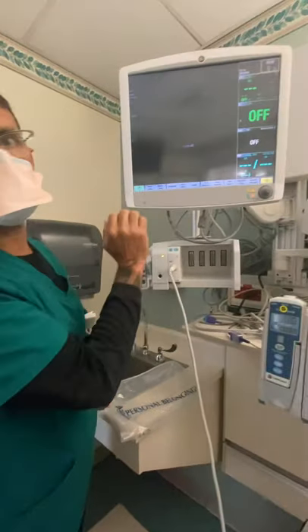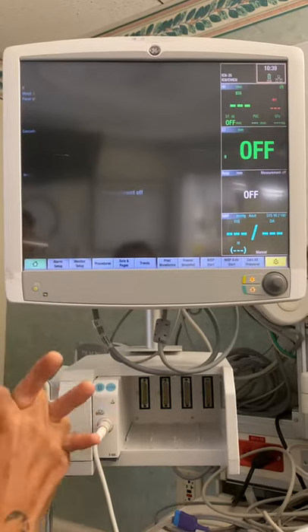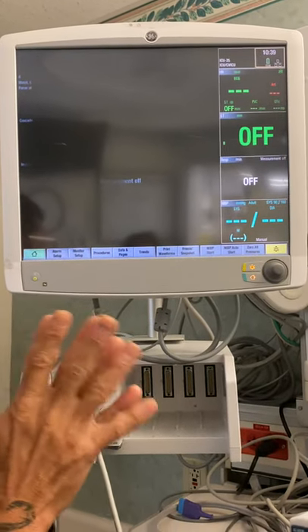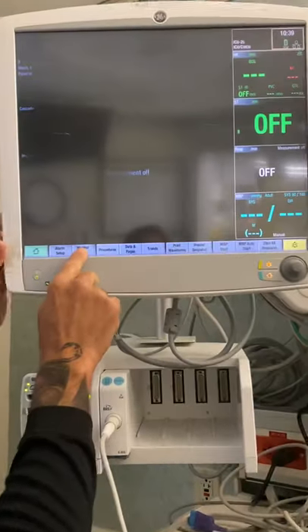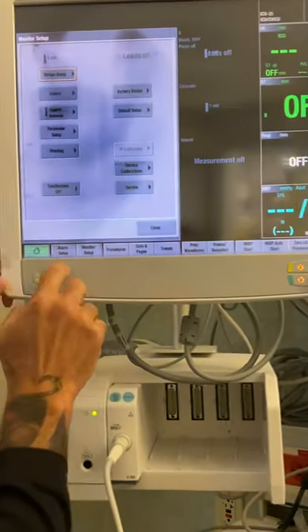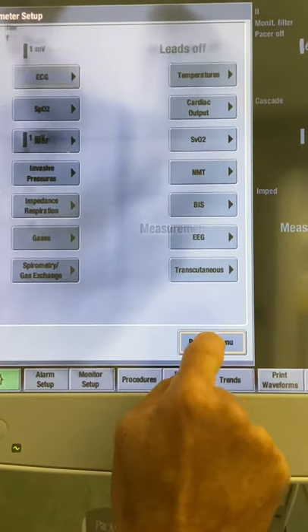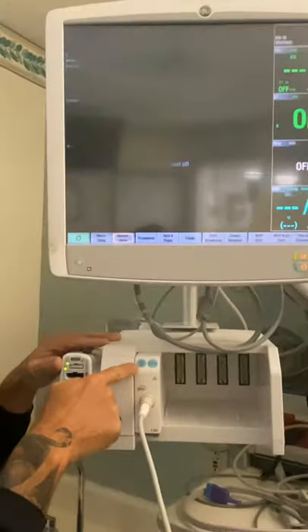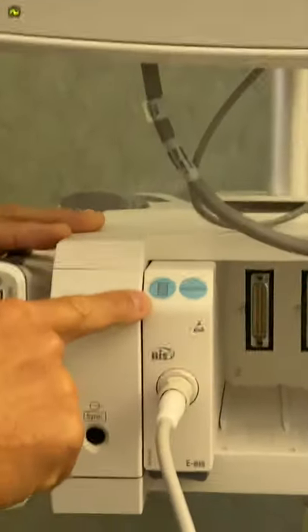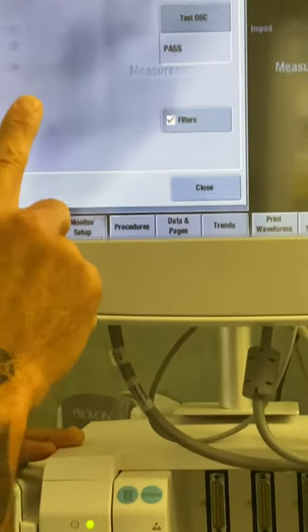Now, if you see the monitor, it has not populated on the monitor. If the monitor has had BIS in the past, it should populate. But if it doesn't, which most of them don't, you go right here to monitor setup, then to parameter setup, and there's your BIS. If you want to get there more easily, go right here on the module to the little paper sign, push that, and it automatically opens the BIS parameter setup.